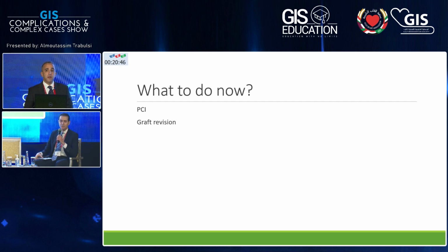I assume it's a short number of hours after the surgery that this complication has taken place. I'm sorry, I can't hear you. Sorry, I apologize. It's a relatively short period of time after this complication took place. So reopening the chest would be very, very simple to do, actually. Sure. But my first obvious thing I'd say is that the proximal vein grafts, I think there's a technical issue with the way that those grafts have been constructed, actually.